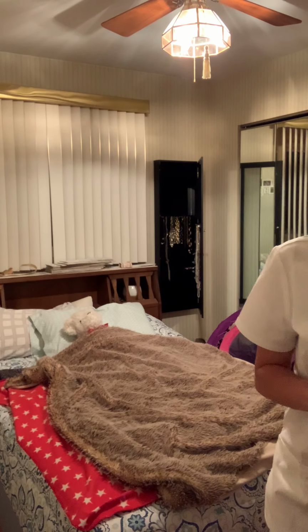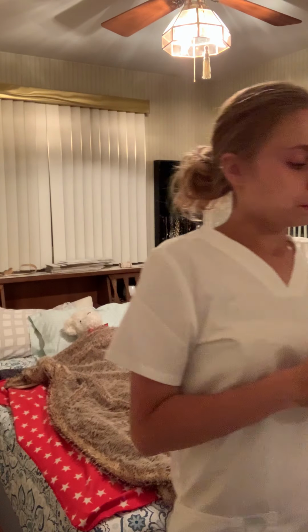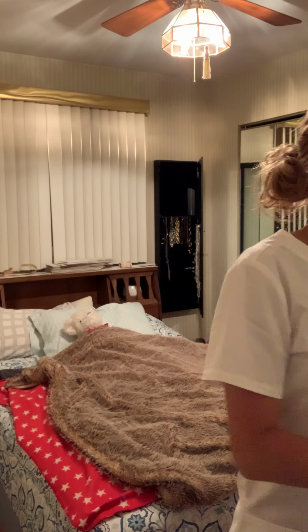So just remember, whatever side you are working at, that is when the bed rail should not be raised. And whatever side you aren't working at, the bed rail should be raised just for safety. So after all that is done, you could raise both of the bed rails. And then we are to straighten and smooth the top linen.